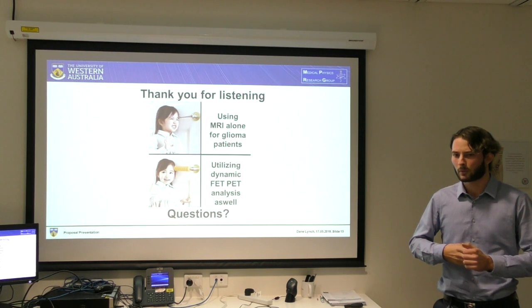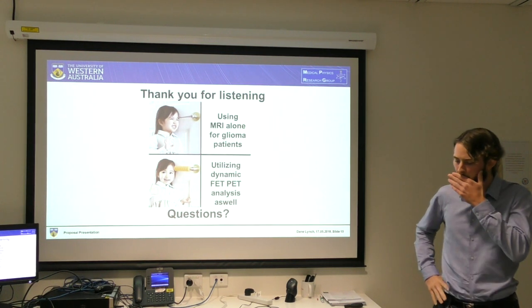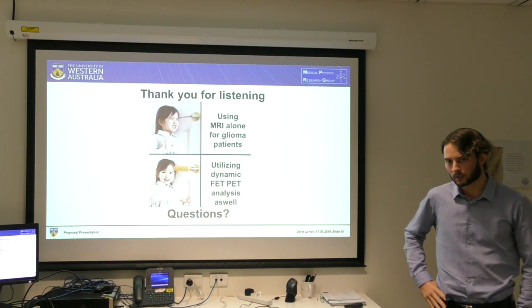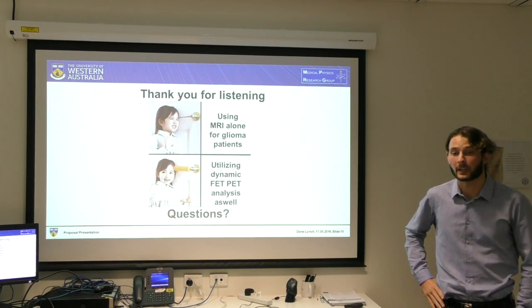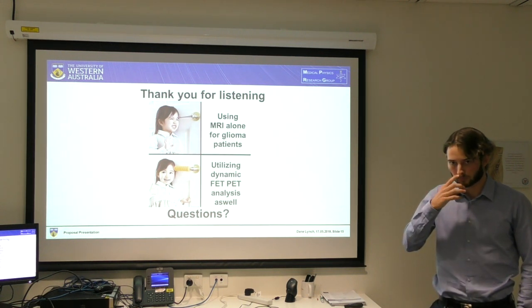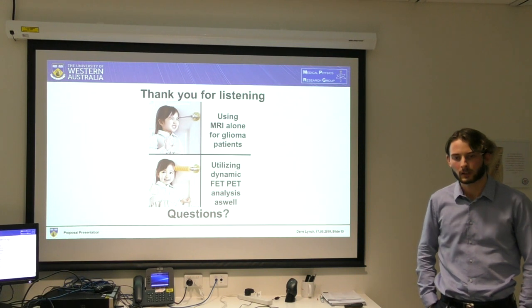At the same time, when they acquire a PET at the same time as the CT, so that then the data sets are automatically fused together, and you can see anatomical data as well as activity data.